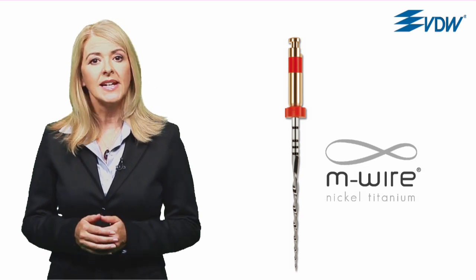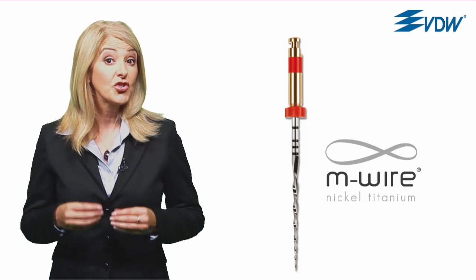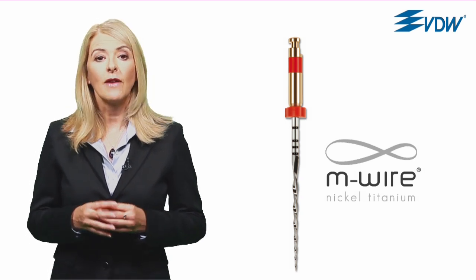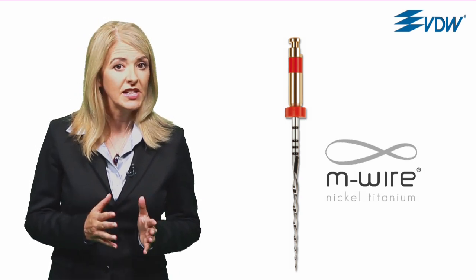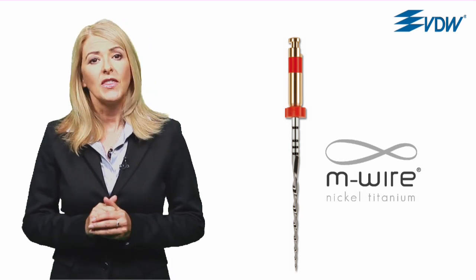Reciproc instruments are made out of M-wire nickel titanium, and compared to traditional nickel titanium, have greater resistance to cyclic fatigue and higher flexibility. For you, that means higher protection against instrument fracture. This precise interplay between the specific reciprocating movement and the properties of the Reciproc instruments is what makes preparation with just one instrument possible and safe.